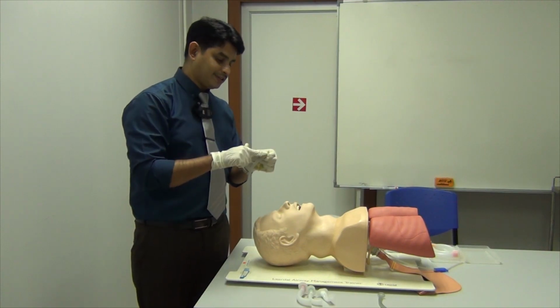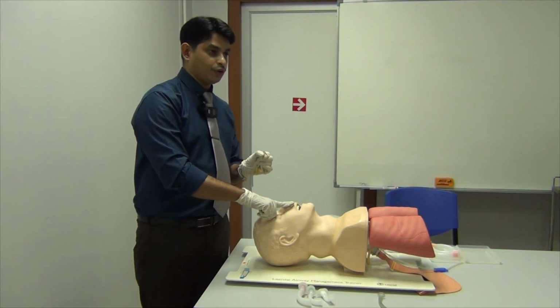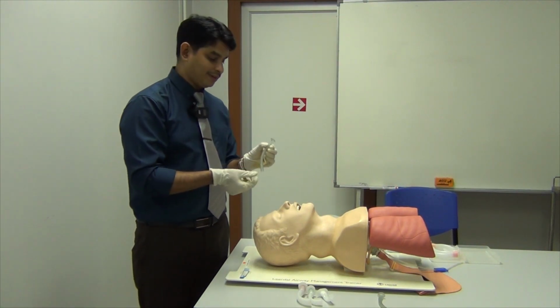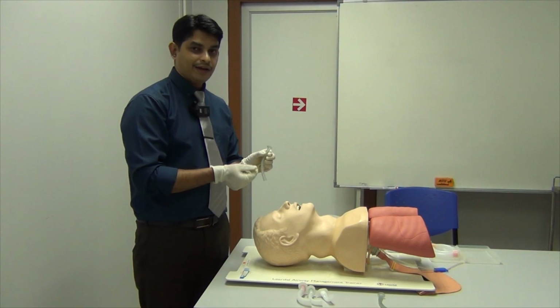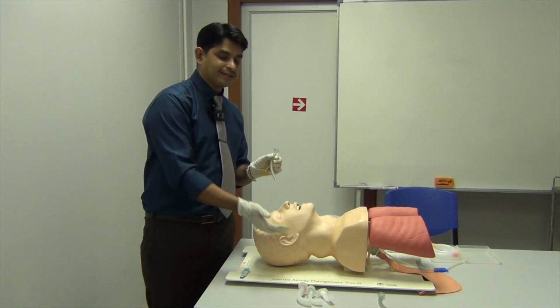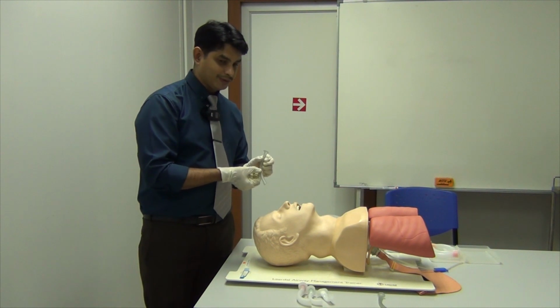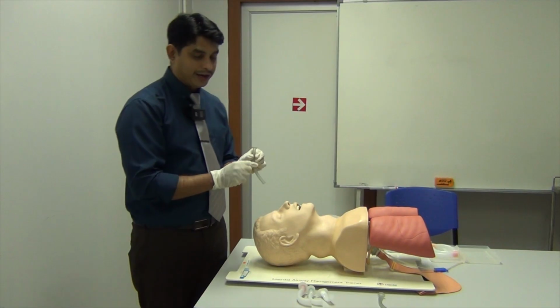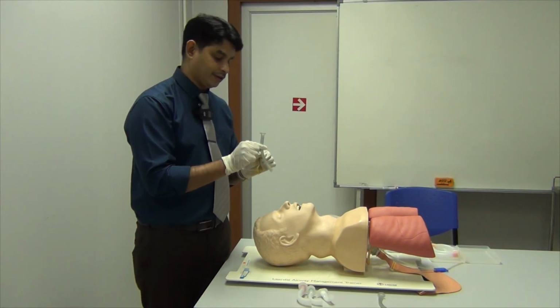The flange sits on top of the nostrils. So the indications: airway obstruction, presence of gag reflex, and always be aware in suspected basal skull fracture, use with caution or do not use at all. And while introducing, be gentle.